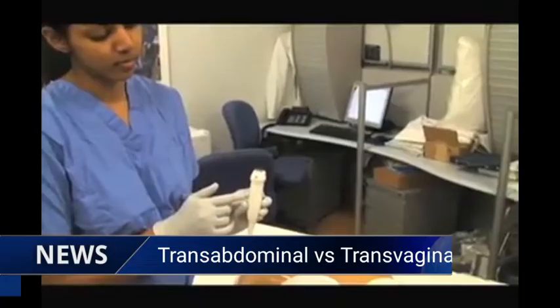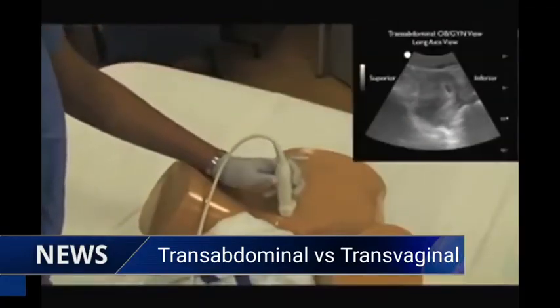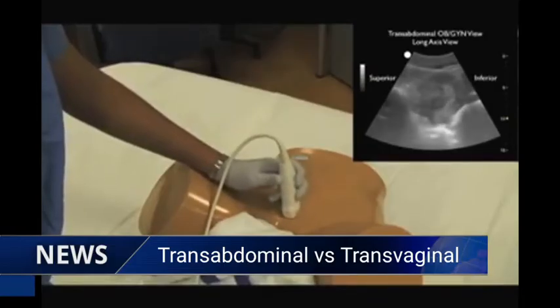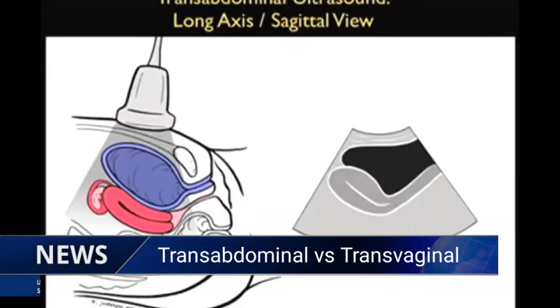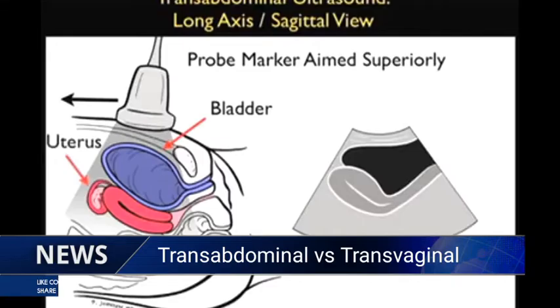This is Dr. Himashi Pereira, a current OBGYN resident at the New York Presbyterian Hospital in New York City, showing the correct placement for the probe for the long axis technique of transabdominal sonography using a phantom or simulation type equipment. Notice the probe marker is oriented towards the patient's head, and we're scanning from side to side along the uterus. Now let's look at an image of how the transabdominal ultrasound view will appear, both pictorially and on the ultrasound screen. Remember that for the transabdominal approach, using a long axis or sagittal view, the probe marker should be aimed superiorly towards the patient's head.